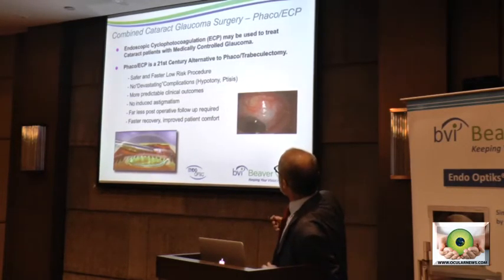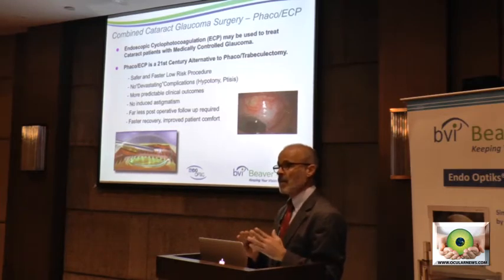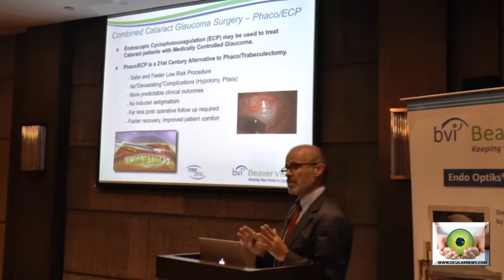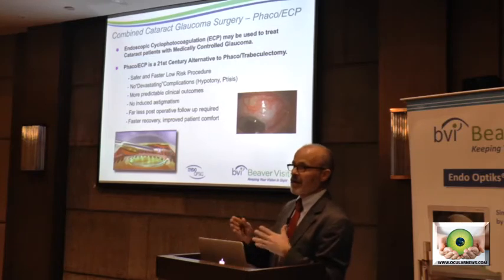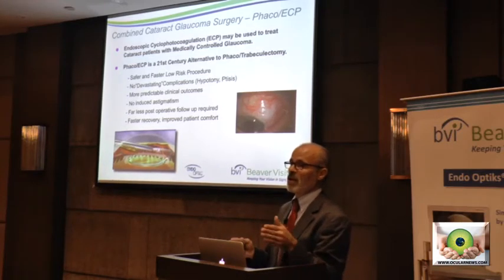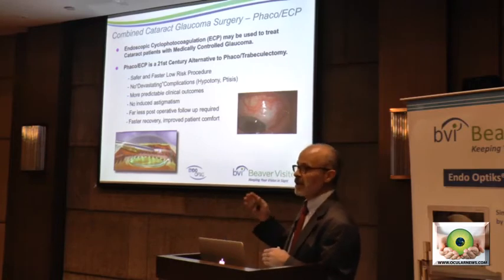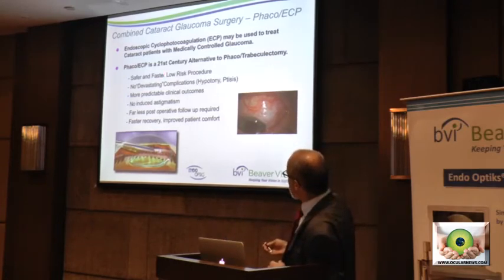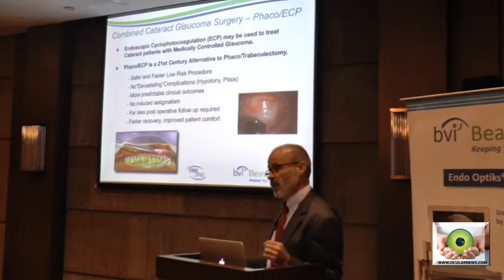So phaco ECP has more or less supplanted combined phaco trabeculectomy. In North America and Europe, it's very rare for someone to combine trabs with phaco. Of course, I think it's been widely observed that you risk compromising both the phaco and the trab by combining them. This is not the case with ECP. It's a faster, lower risk procedure with a predictable drop in pressure.